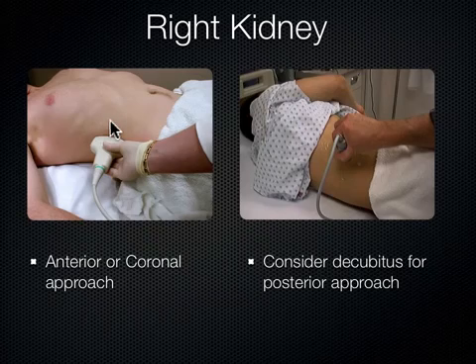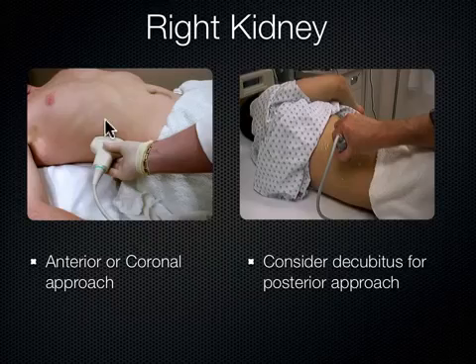Okay, so I'll say that again. From the coronal view, you can drag the probe up anteriorly, and then you're going to tilt the cable towards the ceiling. By doing that, you're fanning the probe, shooting the sound more posteriorly. And actually, many times, that anterior approach, using the liver or the spleen as your window to see into the kidney, is a better way to go than even a coronal view. Every patient's different here. This is the art of sonography we're dabbling in right now.